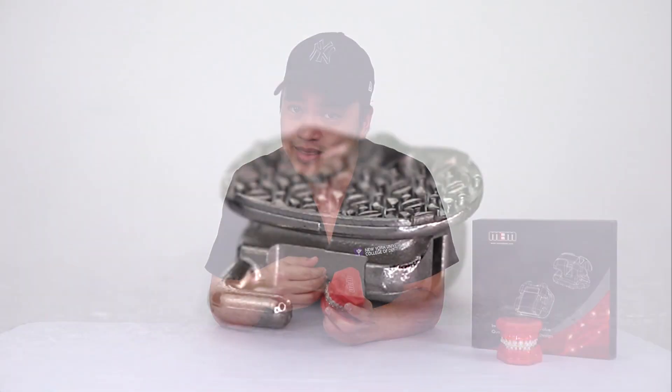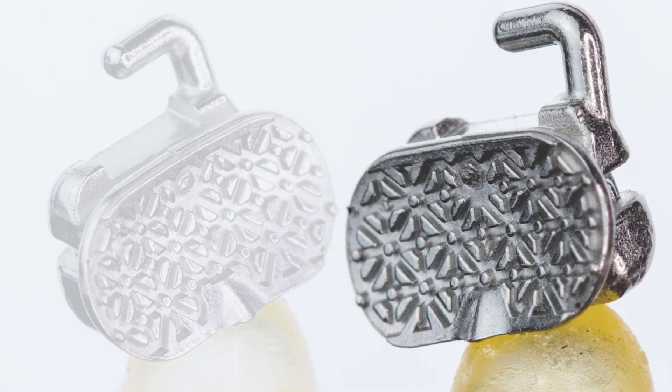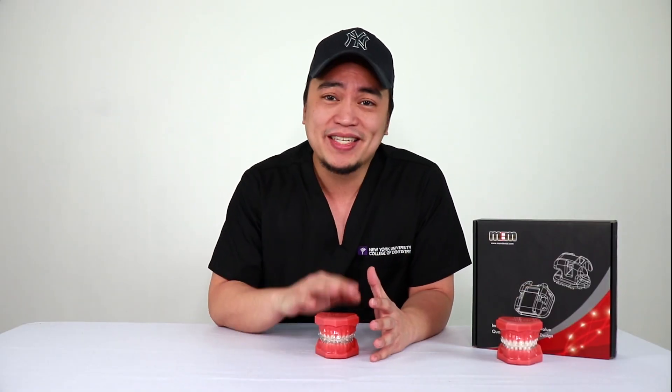One thing that seems very underrated with bracket systems is how well it sticks to your tooth. Because of the way the back of these brackets are designed, the mesh in the back makes it so good. If I were to count how many times I would lose a bracket, it would probably be one every patient. With all those factors combined, that saves me a lot of chair time.